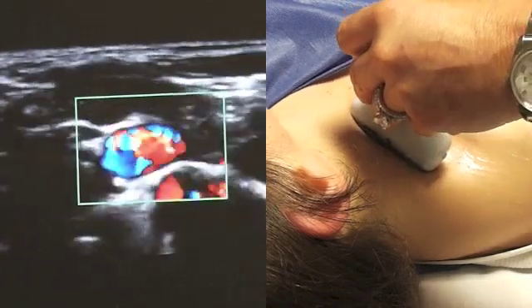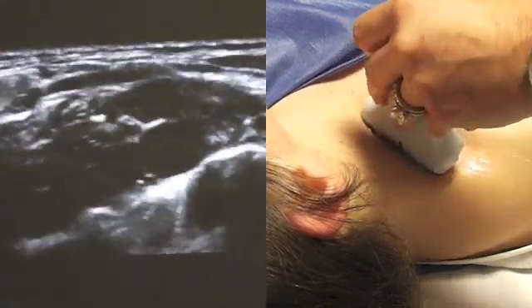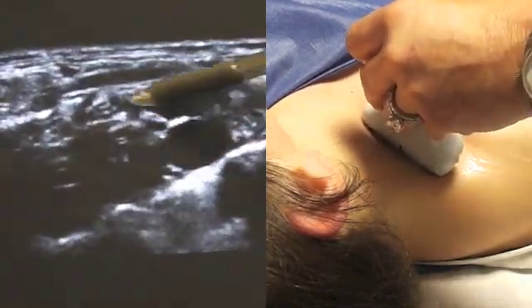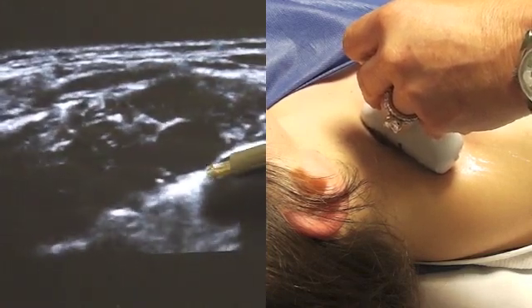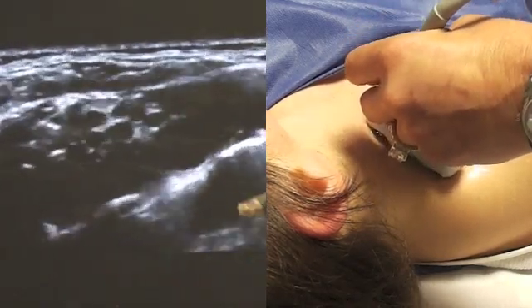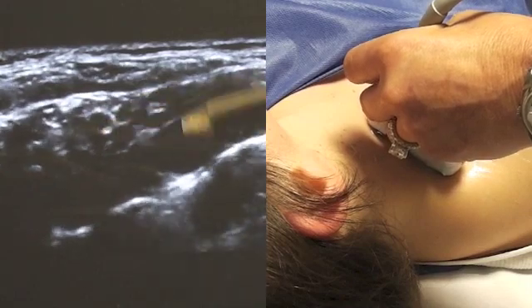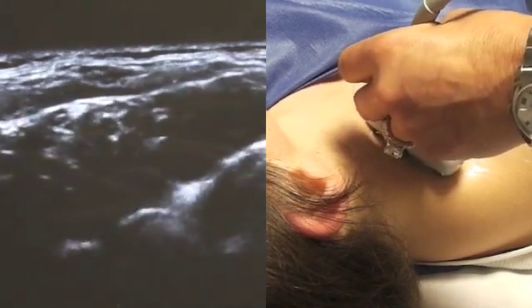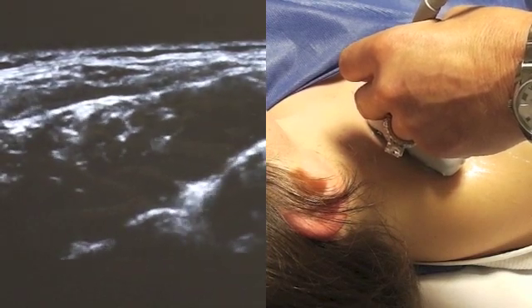I'm going to adjust the probe a little bit, and we're looking for what's typically called the cluster of grapes, which is very well demonstrated right here on this model. The subclavian artery lies immediately above the first rib, and as you scan laterally, you can see the pleura and the lung come into view, and again the cluster of grapes, which is a supraclavicular approach to the brachial plexus. On the left-hand side of the screen is lateral, and on the right-hand side is the medial side of this patient.